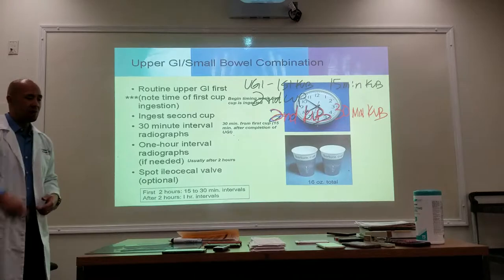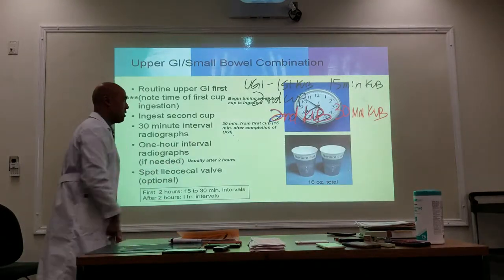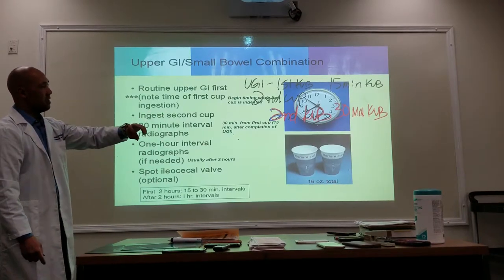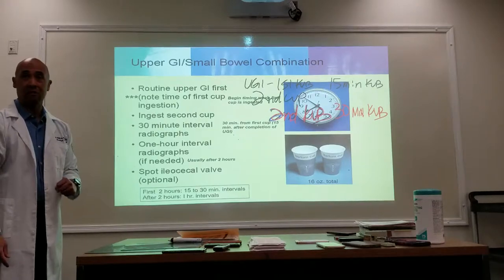So we have them walk around. Then we come back, and now we're going to do our third KUB. Depending on your hospital, it could be the 45-minute shot or it could be the 1 hour shot. You guys follow?